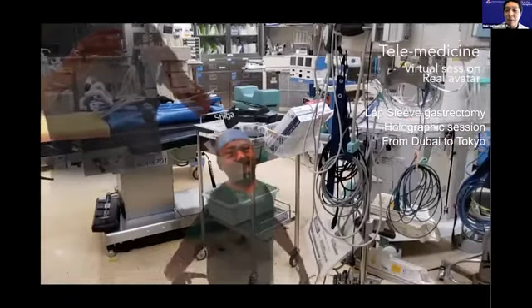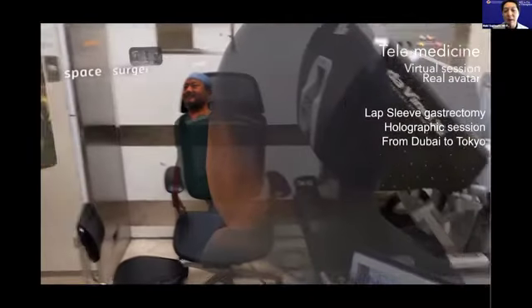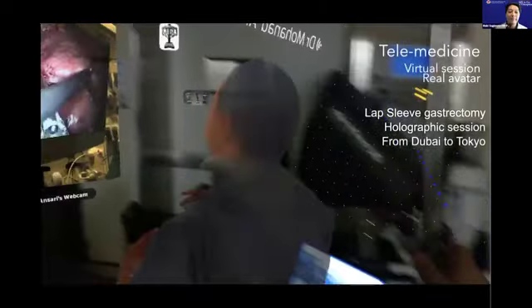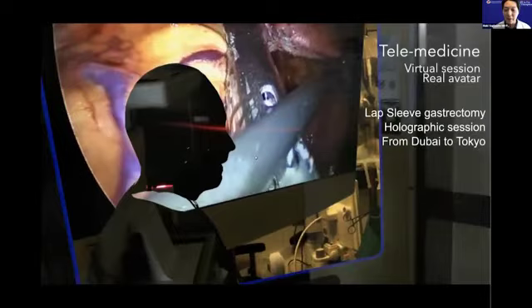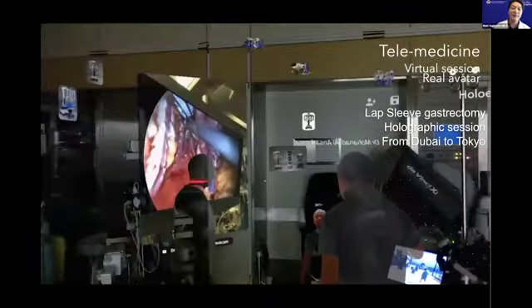We can share the laparoscopic sleeve gastrectomy conference from Dubai to Tokyo. And we can have conferences for this patient, where to cut, where to ligate, and the size of the stomach. So you can see now the uses of this technology in the space that you can see at the International Space Station, so he's now trying to apply it to a space surgery, a real space surgery in the ISS.